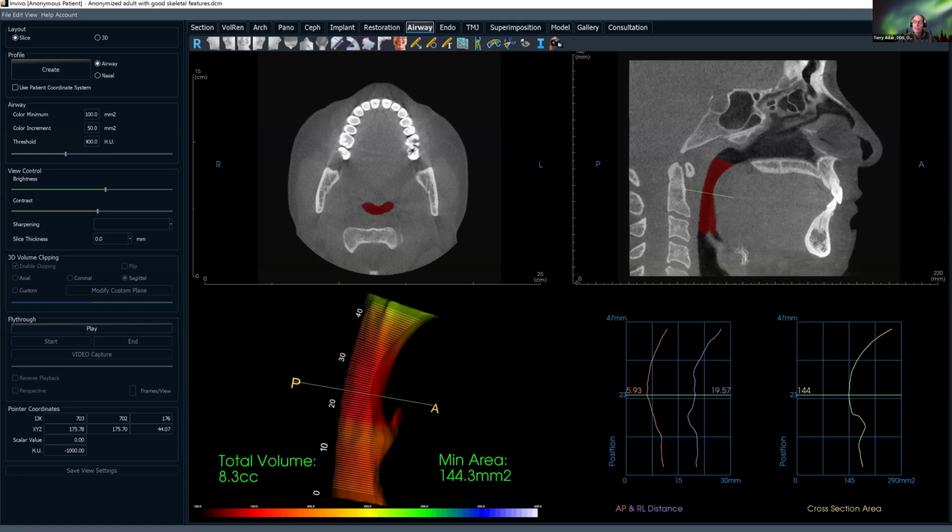I don't see a lot of them. I do see some that I just diagnosed, where there was no note that there was a suspicion of a vertical root fracture. So you can see them, but not as often as we'd like to, particularly if there is a suspicion from the dentist to rule out vertical root fracture.